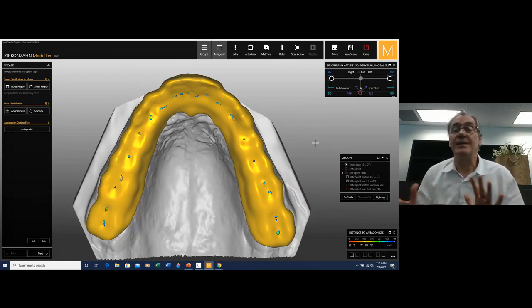This is basically the whole therapy lined up in 3 parts. So what relates to the articulator, to what relates to the phases of odontoplasty and how we recover this information and improve it through the next phase.